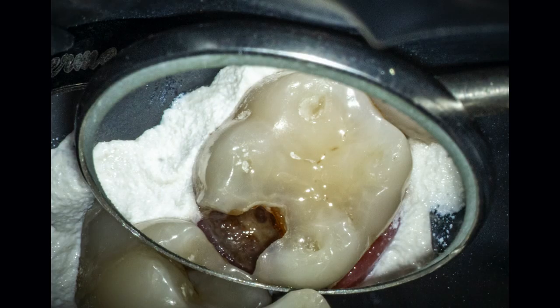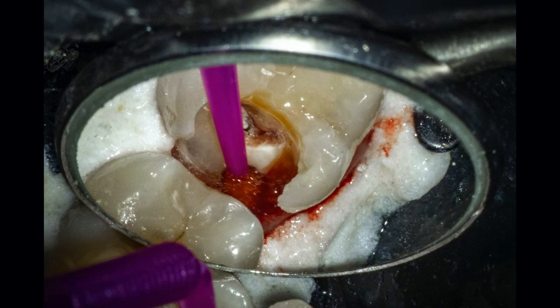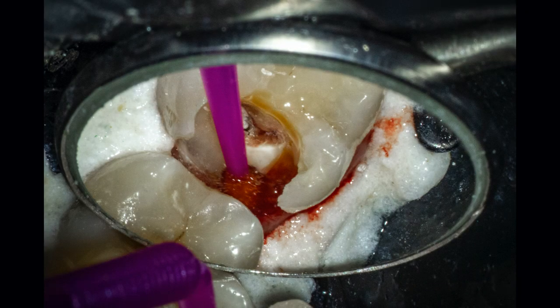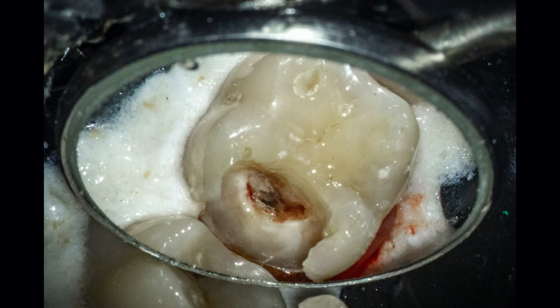The caries was excavated and the pulp exposure was clear. This is another one of those situations where the lesion was in very close proximity to those gingival tissues, which can cause some hemorrhaging. So I like to try to manage that very early on in the case so that it doesn't affect me throughout the course of my treatment. Using a little bit of ferric sulfate on the end of a micro brush, I can place it on the gingival tissues to easily control the field.